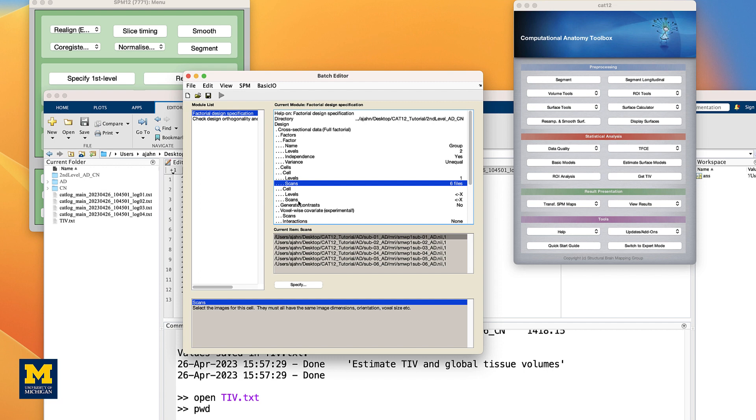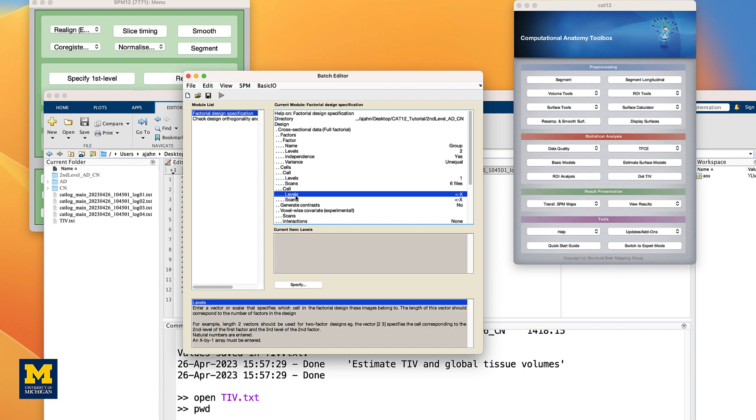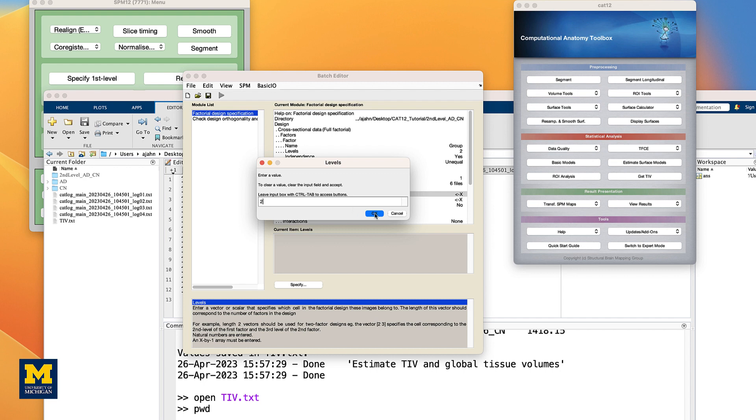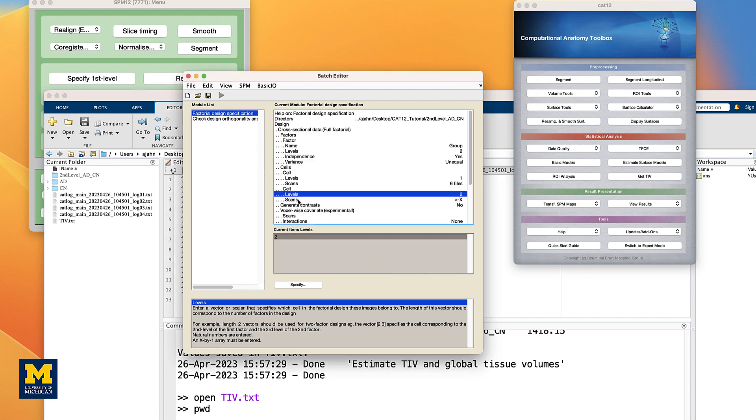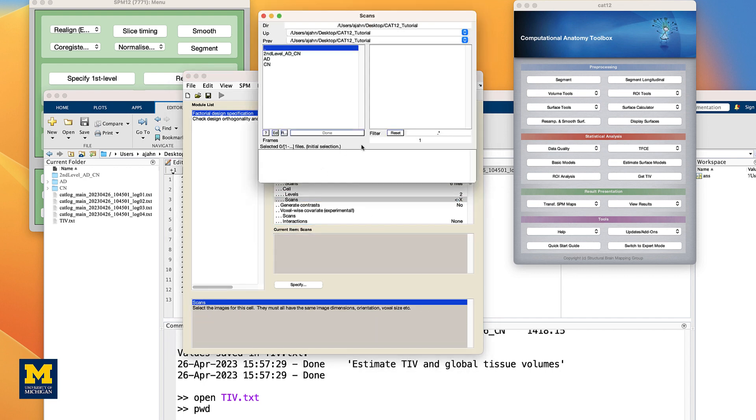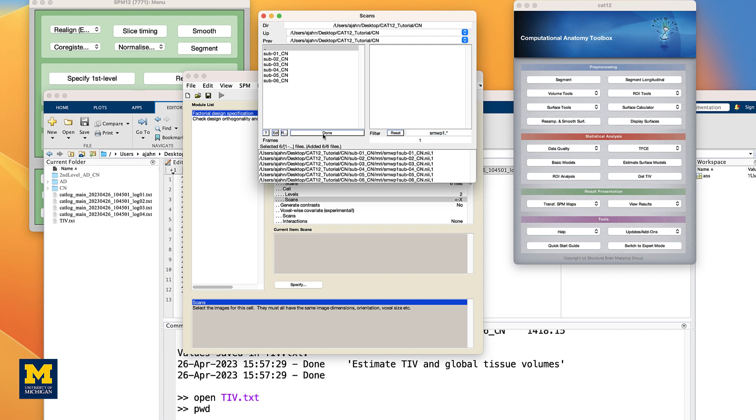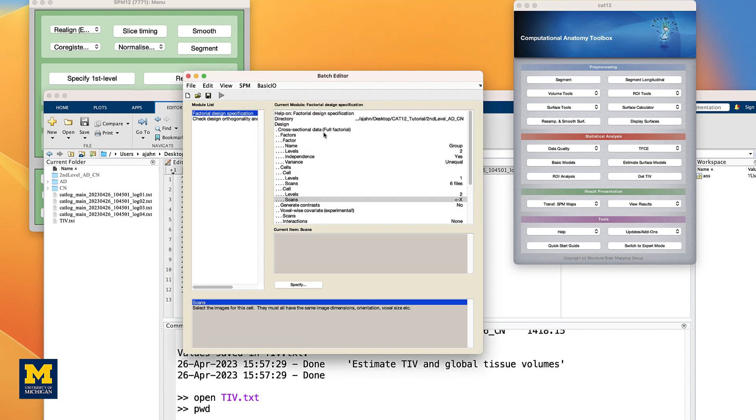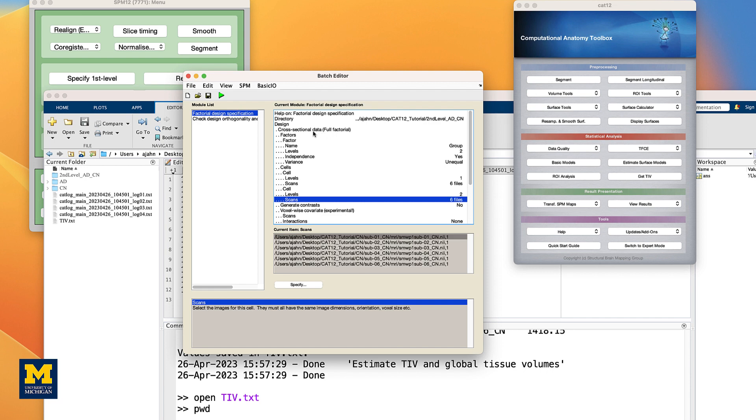Now, do the same for the next cell. Entering a level of 2, and then for the scans, navigating to the CN directory, entering SMWP1 in the filter field, and clicking the Rec button. And then Done.